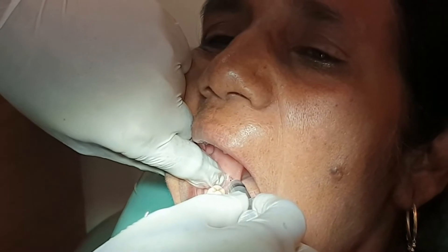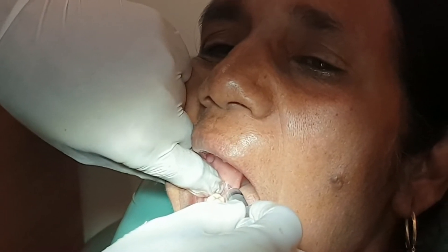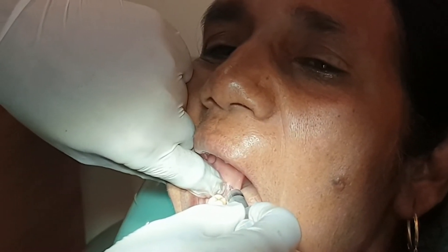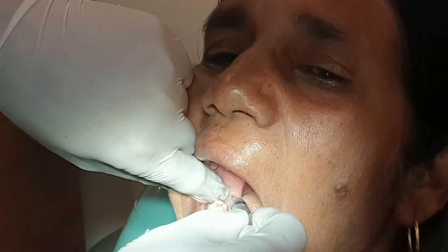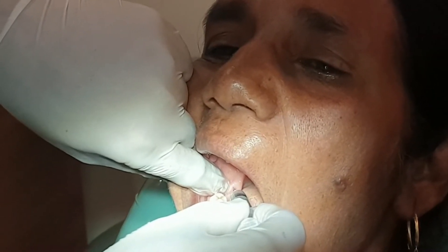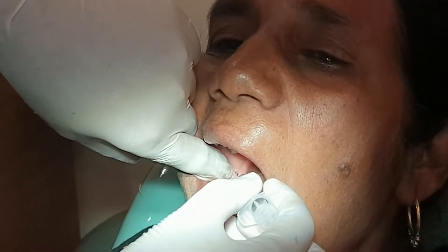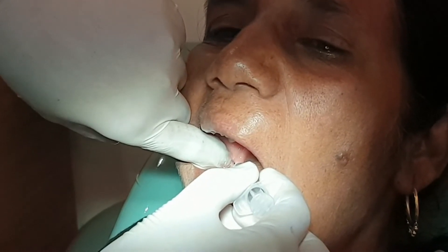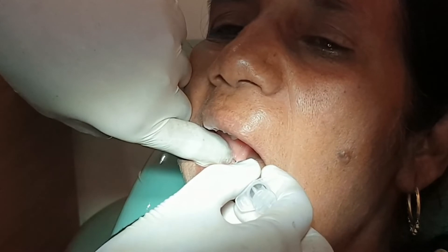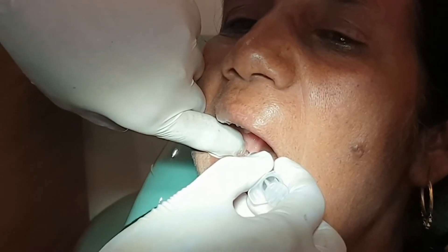Once we have hit the bone, we check how much of the needle has been inserted. Approximately half to three-quarters of the needle length should be inside when bone contact is made. If the bone is hit immediately after inserting, we have contacted the Internal Oblique Ridge. If the complete needle is inside the tissues, we are at the posterior border of the mandible. In no condition should the solution be deposited if no contact with bone has been made.